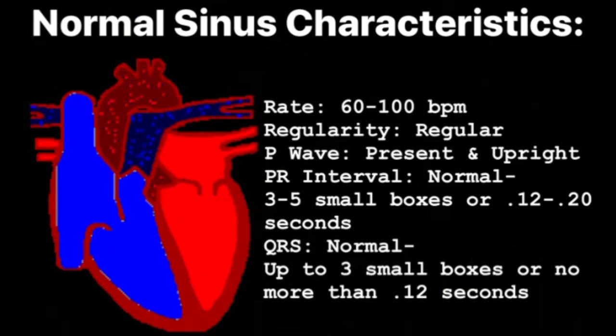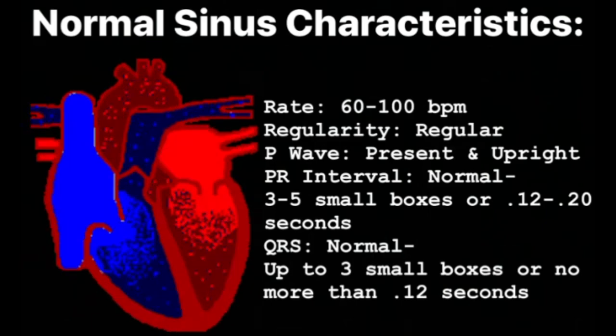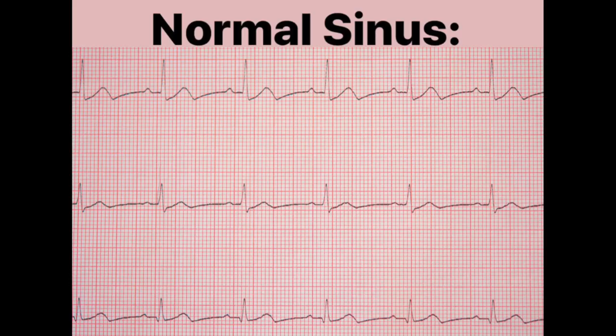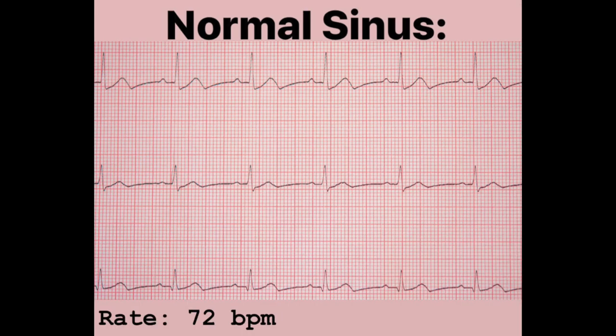Let's take a look at a normal sinus rhythm on an EKG strip. Taking a quick glance at this, everything looks pretty regular and everything looks like it's there, but let's go through our checklist and make sure it is normal sinus. The first thing we want to check is the rate. Our rate is going to be 72 beats per minute, which is normal — it falls within 60 to 100 beats per minute.